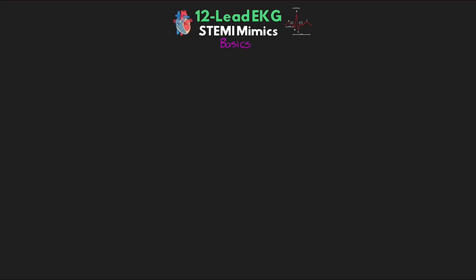So before we get into talking about these different conditions, just know that in this lesson, I'm going to go quickly through each of these common STEMI mimics. In reality, several of these really warrant their own dedicated future lesson, although not necessarily a part of this 12-lead EKG series. I do have several of them on my to-do list to get to in the future, but I do encourage you to learn more about these to further your own understanding.